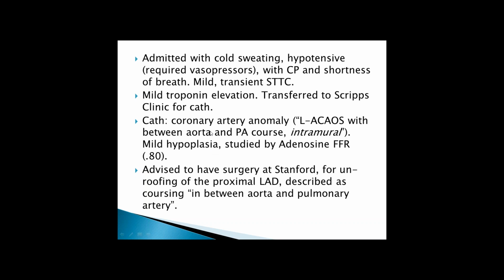They studied this possible cause of ischemia by adenosine FFR, the fractional flow reserve, which was mildly limited. 0.8 is the discriminatory or borderline value for significant stenosis. Usually it goes with a 70% stenosis that reduces the maximum flow capacity.